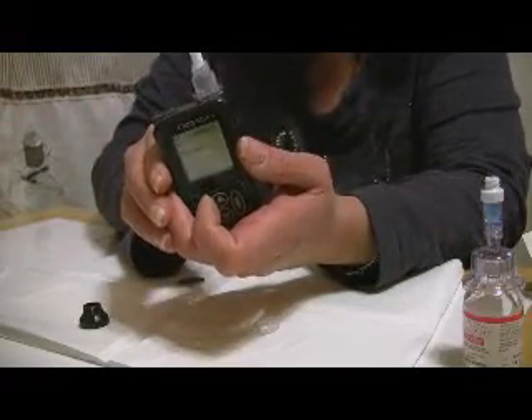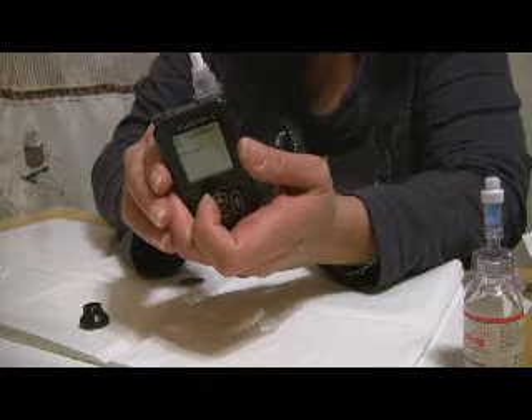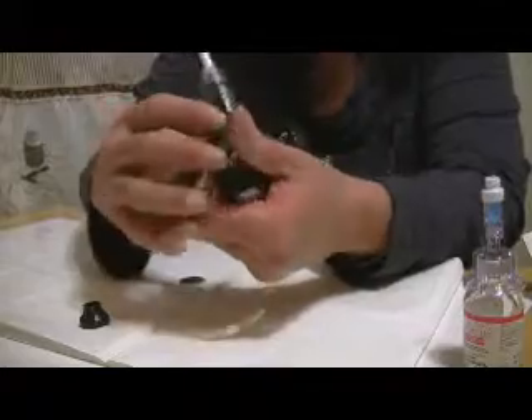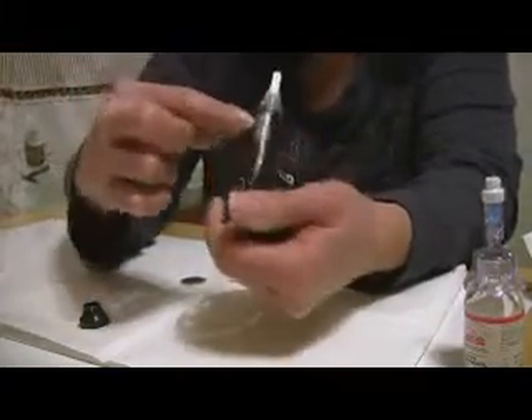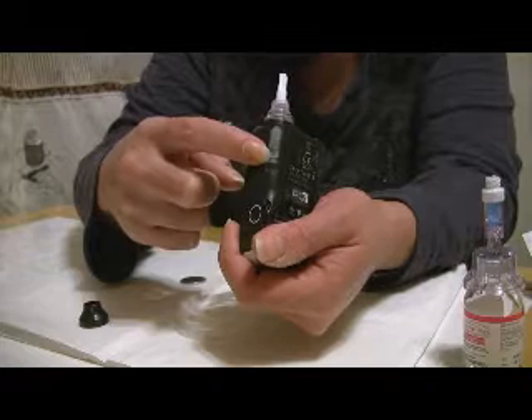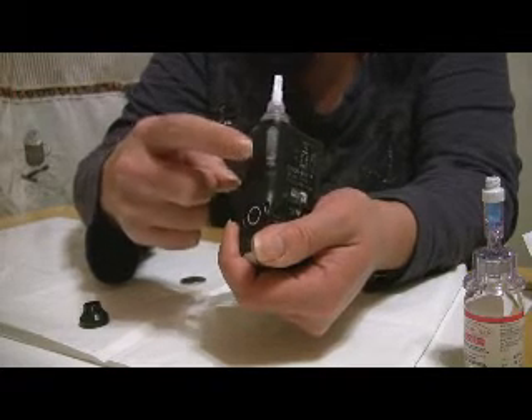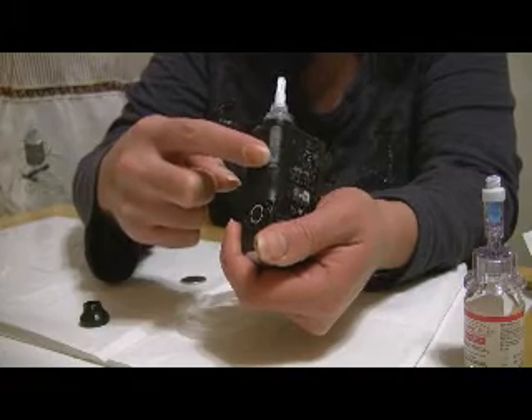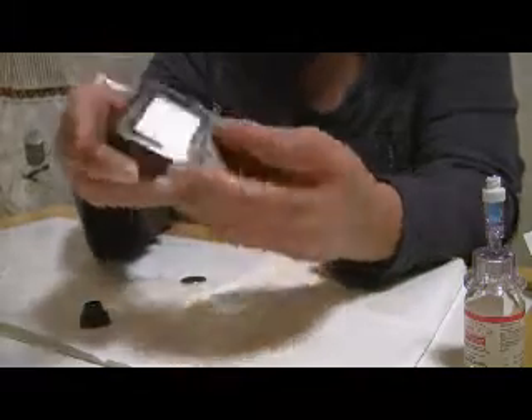We don't need the cap that comes with it either, because that again is for when you're changing sites, so that can go to the side. You can see this is still loading — it does take a minute to get in there. You can also see that they have a little window on the back that shows you how far the cassette has gone in, and it's also good for seeing how much medication is left if you don't look at the meter on the front.